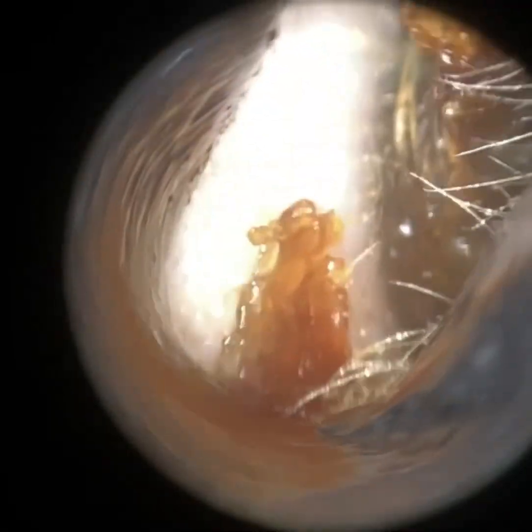We have got different speculum sizes — this is the 3.5mm. We've got a 4.25mm, and we've got a 5 and a 5.75. If I'm honest, I've never really had to go above the 4.25. If I just had the 3.5, I think I'd be fine as well. You can see we've got an opening at the top — a slit — and that slit is really, really useful. It helps with the manoeuvrability of the sucker.